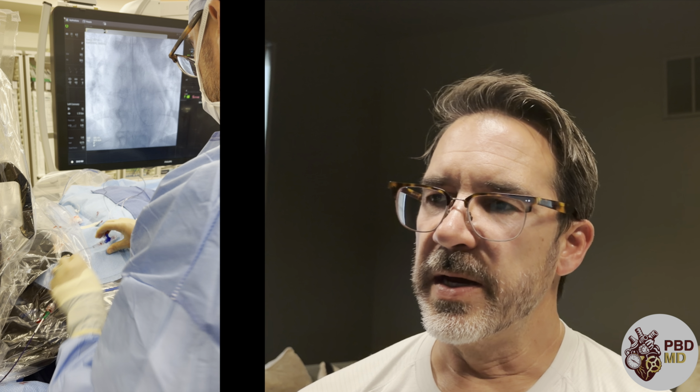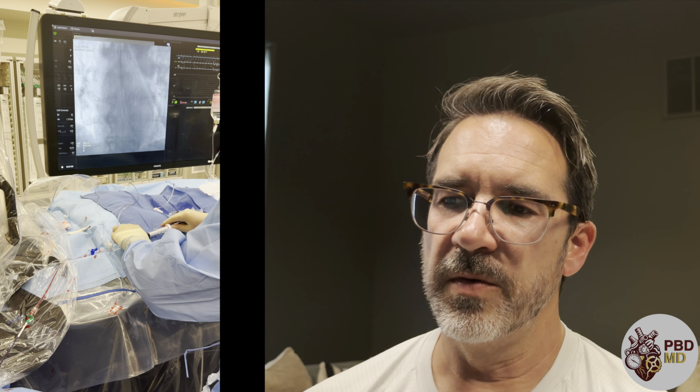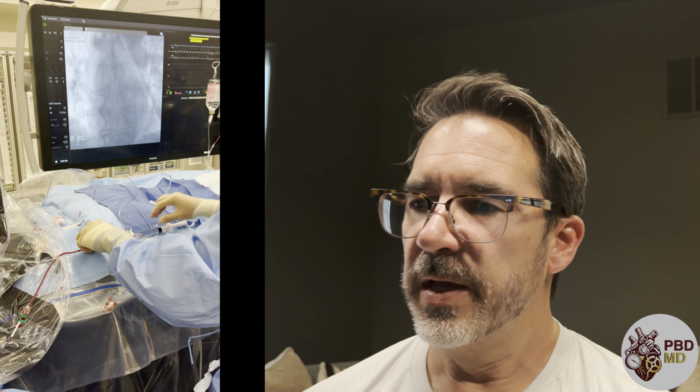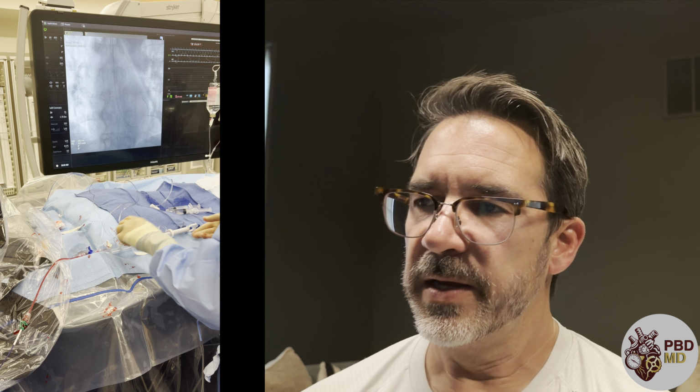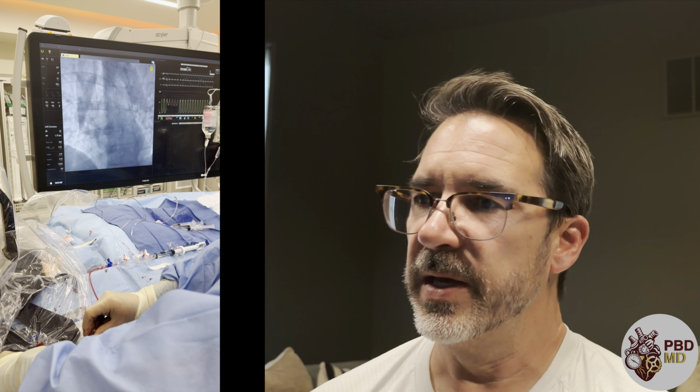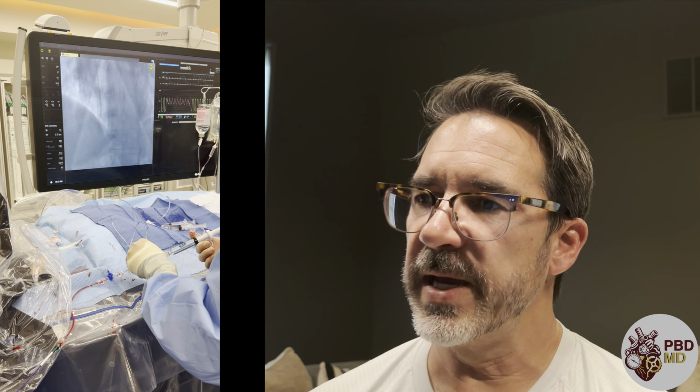So going down to the short end of the candy cane with the wire, and then over that wire we run our catheter. Catheter is just a long straw, and we can inject our contrast dye through that catheter. The contrast dye is opaque to radiation, so as we inject it, it looks dark. Now you'll see me kind of moving my hands. I'm just moving the catheter to get it into the proper blood vessel.